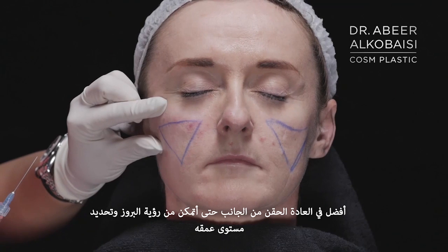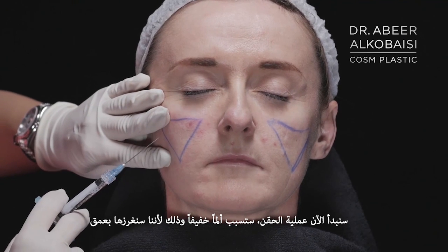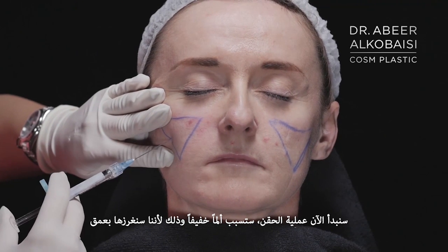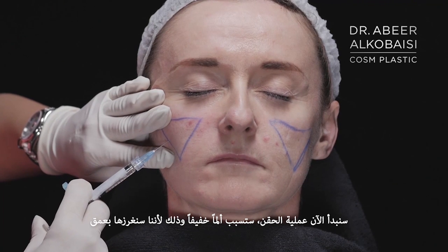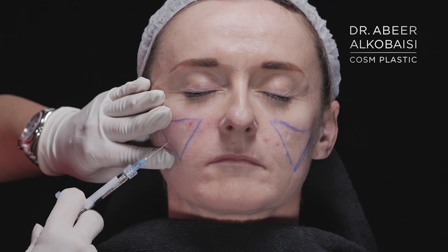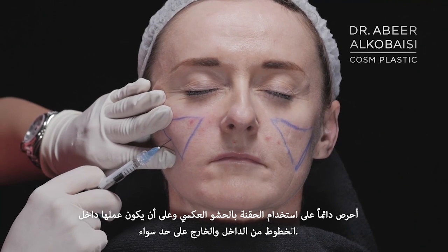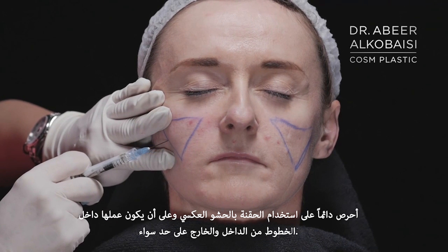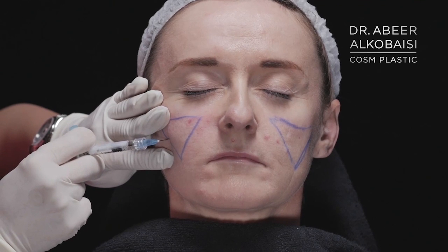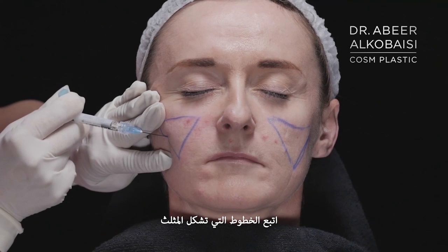So I usually prefer to do the injection from the side because I can see the projection, how far it goes. So we're gonna start the injection. That's gonna hurt a little bit on me. I have to go deep and start injecting. My injection is always retrograde and in lines, in and out. Are you okay? In and out, in and out. And the triangle is guiding me.